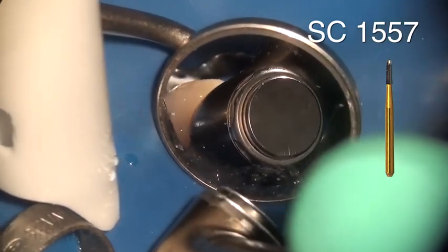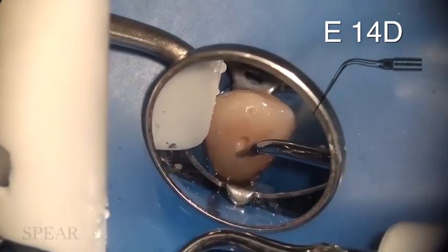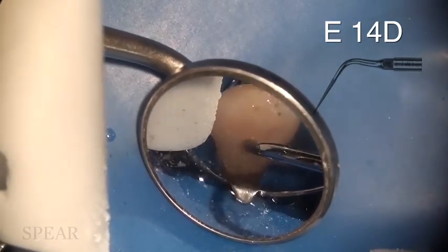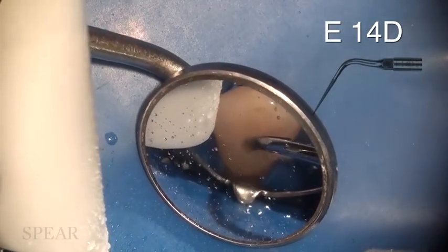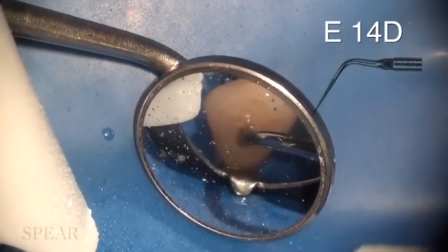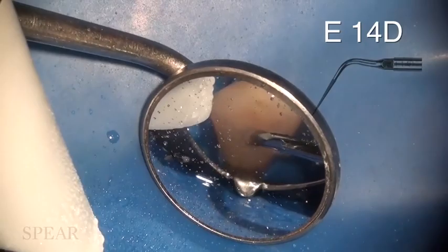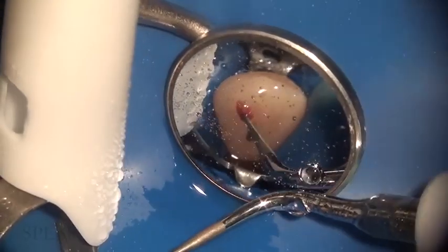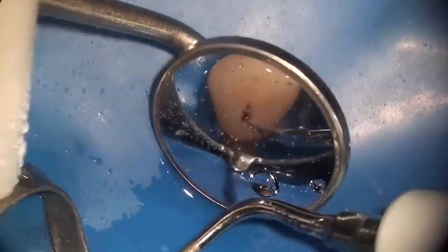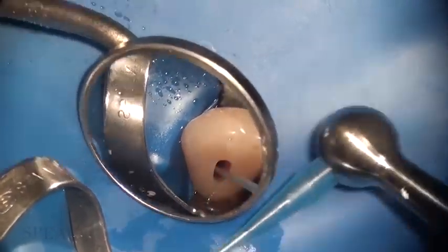So we had a little bit of the lingual aspect of the roof of the pulp chamber left here, and I used the 1557 again. I could have used the slow speed round burr as well, in an upwards direction, to remove the roof of the pulp chamber. I'm refining it now with the E14D, at the same time removing the cut debris. You're laying it against this surface and going in a very oval shape, very gently. This is at about a 3 or 4 power setting. Look at that. There's a little piece of coagulation necrosis, as this tooth recently became necrotic. So this is basically the access preparation, very quickly, on the canine.